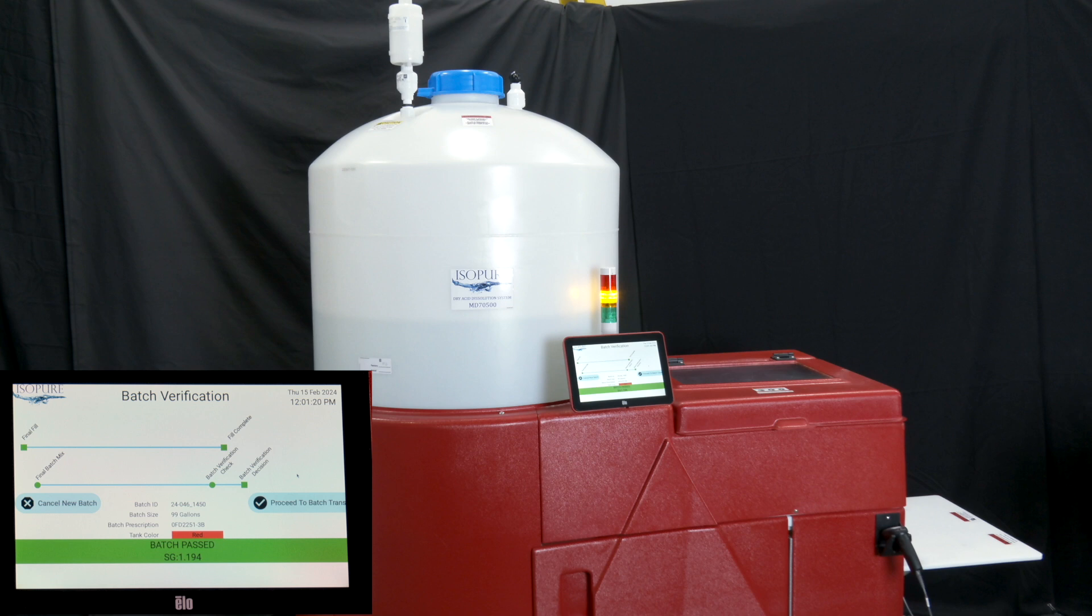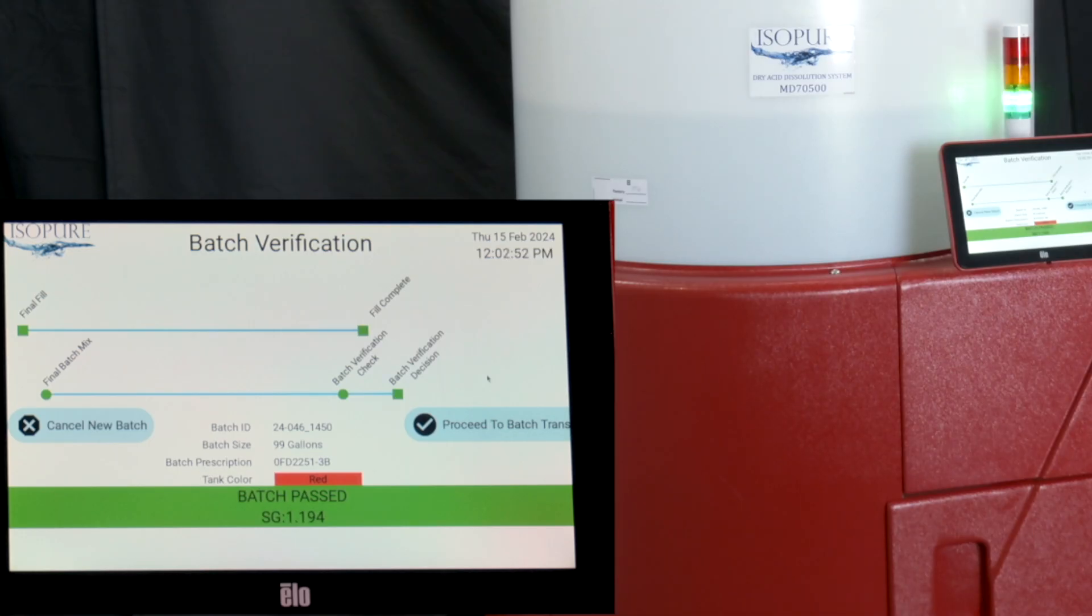Confirm that the displayed specific gravity is within the correct parameters and that the displayed storage tank is correct. Also, follow existing clinic procedures for confirming and transferring a new batch of mixed acid. When done, select Proceed to Transfer to continue.